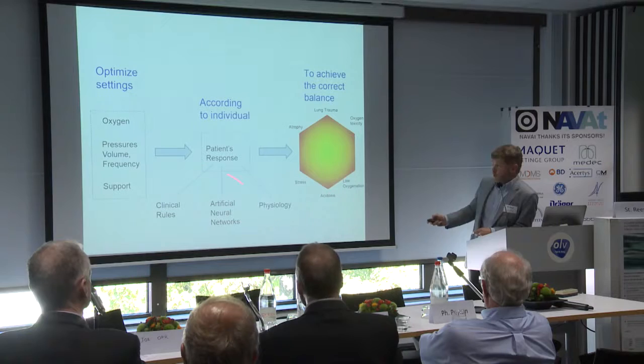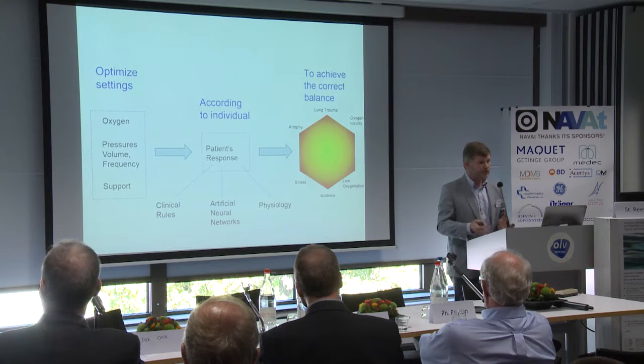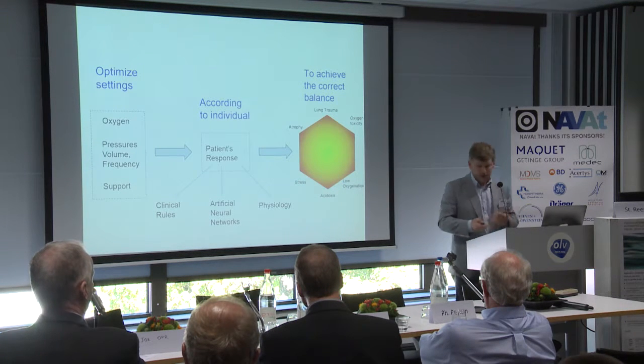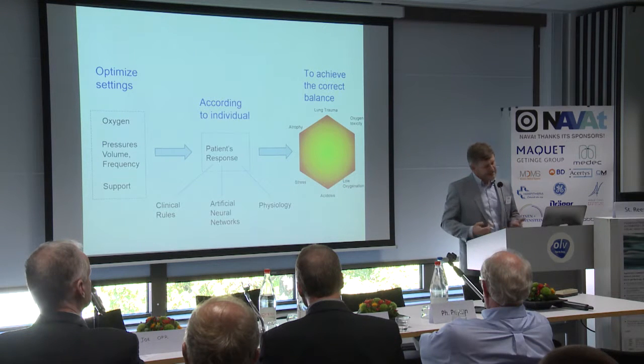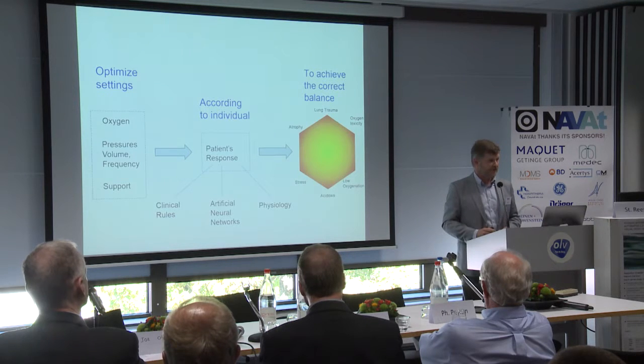Okay? One can implement neural networks or other black box model techniques which correlate statistically inputs and outputs, learn standard patterns and implement those. Or one can go back to physiology, and I'm sure by now you can guess what I prefer, but these are the tools we have at our disposal.